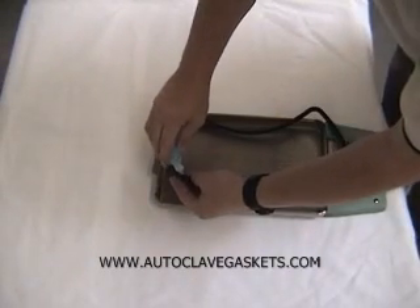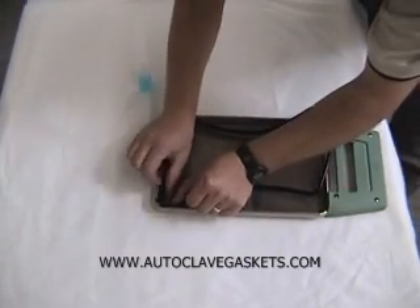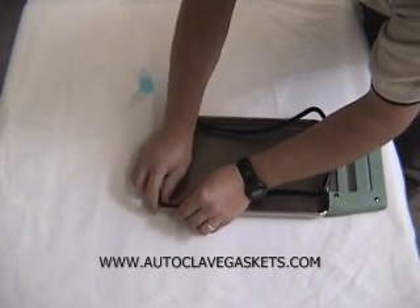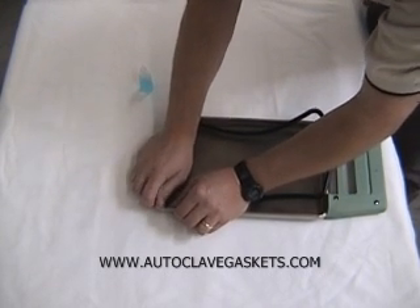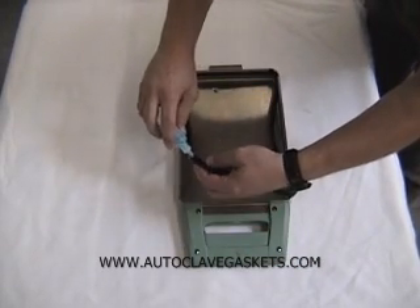Put a little more lube on up here. Move into this corner, and the real trick is getting the alignment tab in there just right. Move it back if you need to. Move into this corner, and a little more lube.